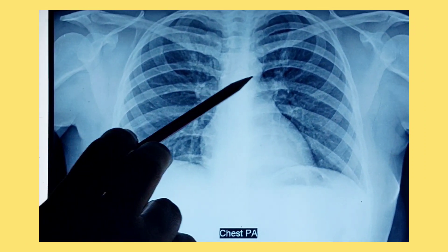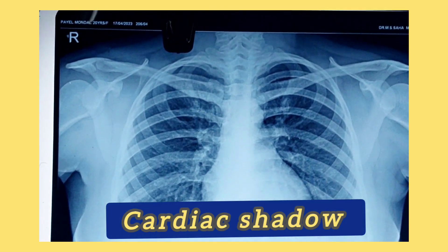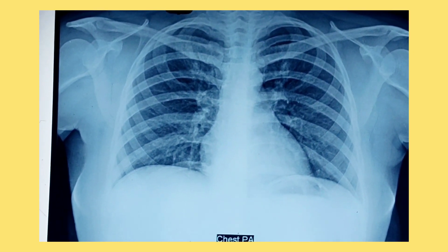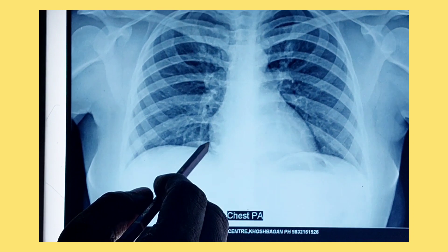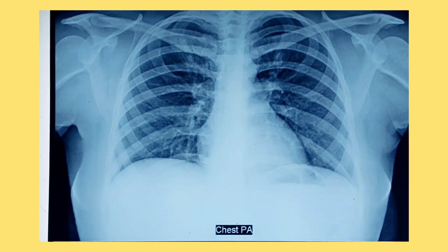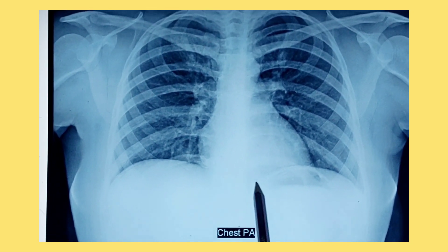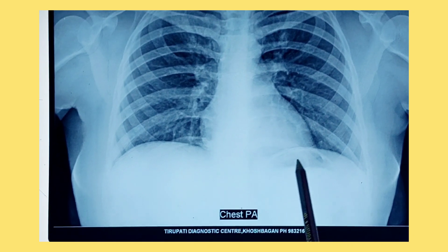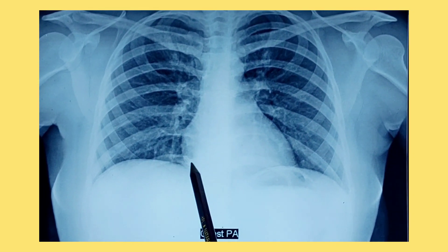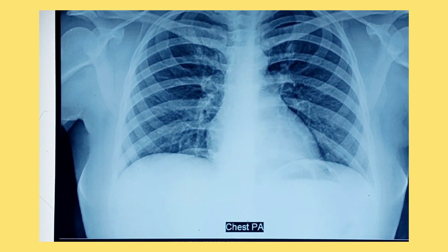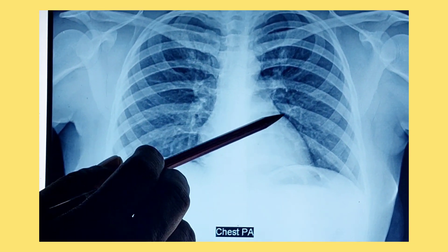In these radiopaque areas, the cardiac shadow is mainly assessed. You may be asked to show the right border of the heart — this is the right border, which is formed by the right atrium. You may be asked to show the inferior border — this is the inferior border, but you cannot show it clearly because it is obscured by the diaphragm shadow. The inferior border is formed by the right ventricle. The left border, which is formed by the left ventricle, is clearly visible.